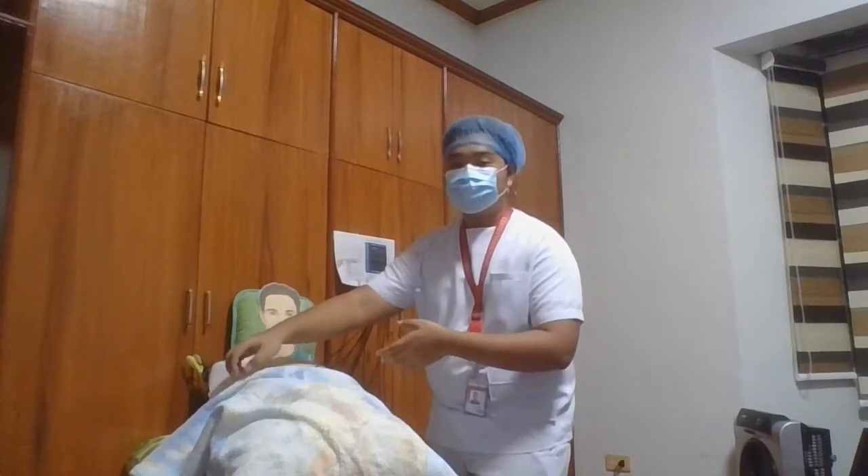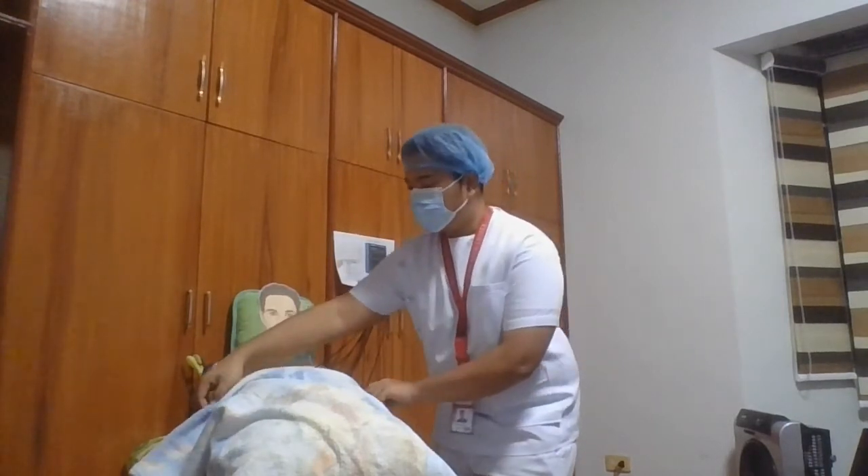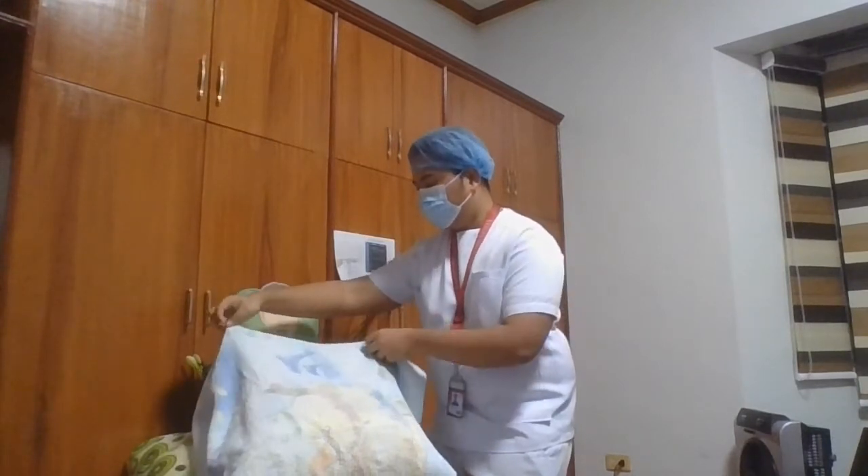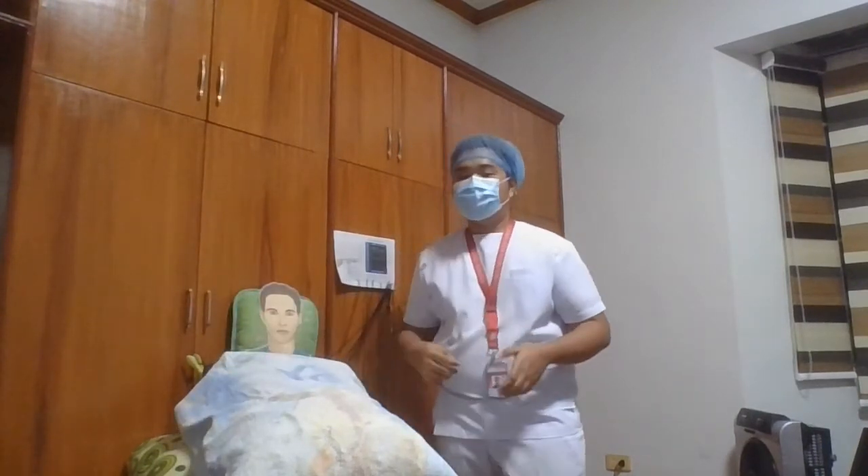So we're going to assist the patient in redressing. Sir, I'm going to cover you with a blanket again. And then after assisting our patient in redressing, we're going to assist him in repositioning for comfort and safety. And then we need to clean, disinfect, and store the cables as well as the EKG machine according to our facility protocol. We also need to dispose of the electrodes and other used materials according to the facility protocol.